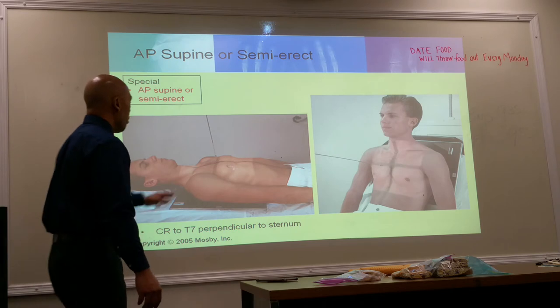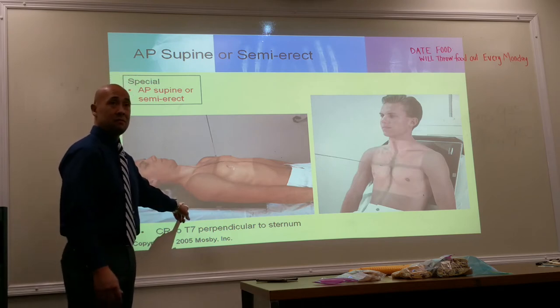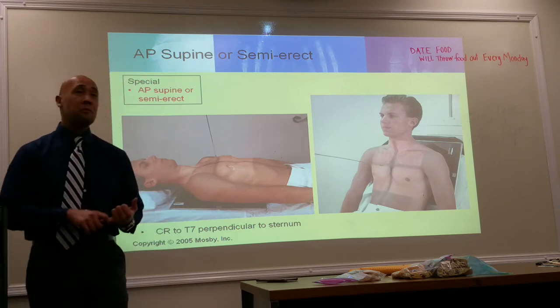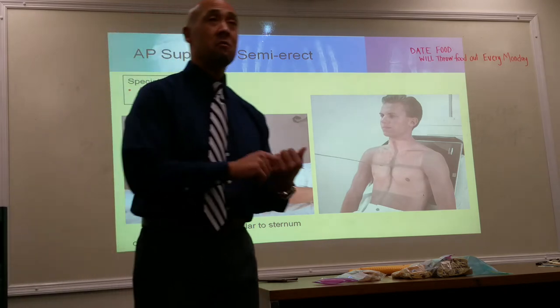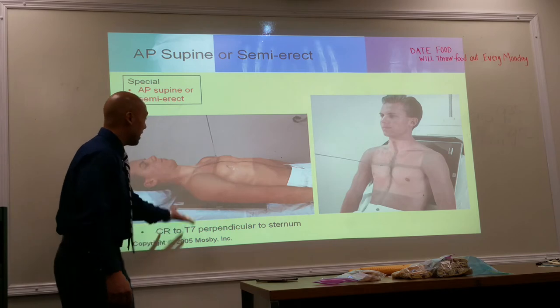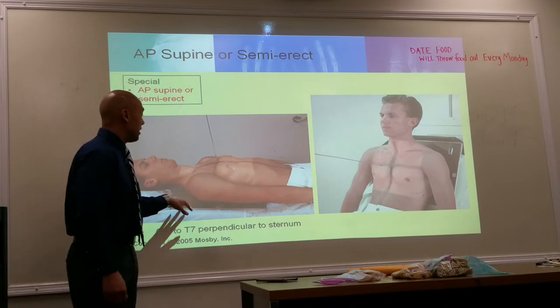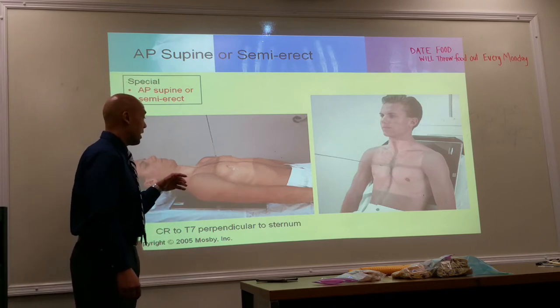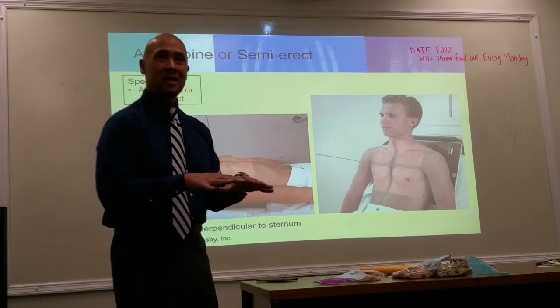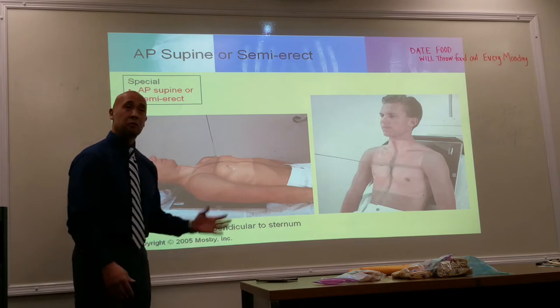Okay. When they're like this, you got to somehow get the imaging plate underneath the table, underneath the patient, right? This is on their bed or their gurney. How are you going to do that? Okay. Well, first of all, don't be afraid to ask for help. If you go to the emergency room and you go to ICU and you've got a patient who's dead weight like this, get somebody to help you so they can help brace the patient and you can slide the image receptor underneath. What works very well is that if they are on a gurney or if they're on a bed, the sheet underneath them is usually made of some kind of slippery nylon material, so it's easy to get that plate underneath them without any help. Okay? But otherwise, get help. Don't be afraid to ask.